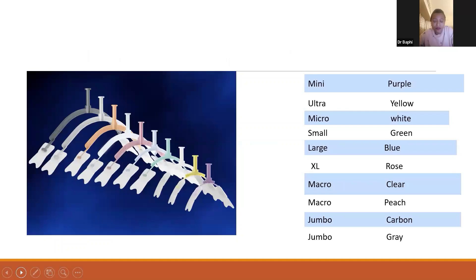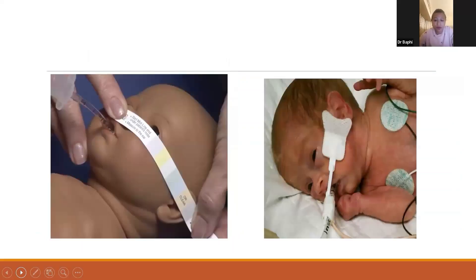These are examples of the ET tube fixation device. Color-coding is present and we can select the appropriate size based on that. To check for the correct size of the Neobar, we use the strip provided along with it — a color-coded strip that comes with the device.